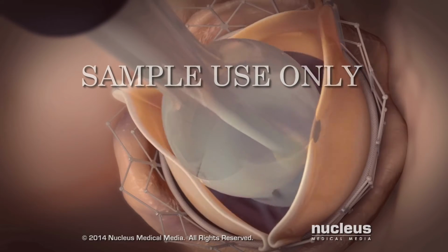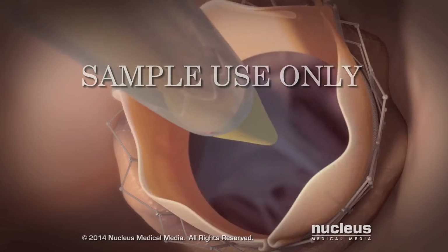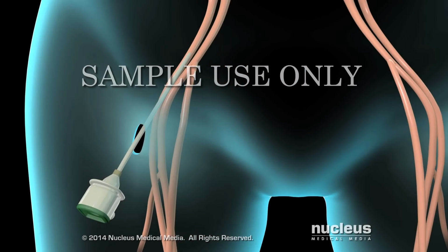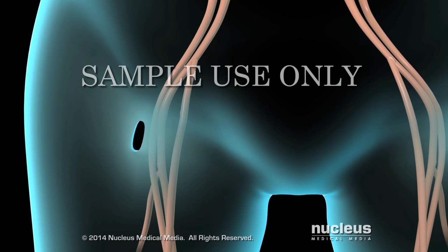After placement of the new aortic valve, your surgeon will deflate the balloon. The stent will support and secure the replacement valve in place. The catheter and guide wire will be removed. At the end of your procedure, the introducer sheath in your groin will be removed. Your skin incision will be closed with stitches.